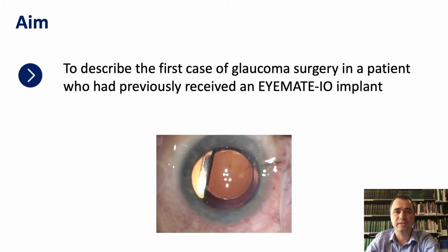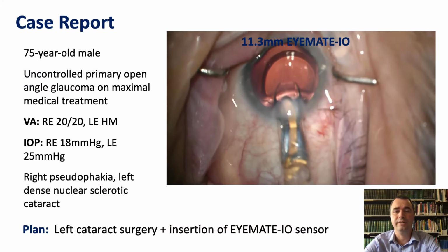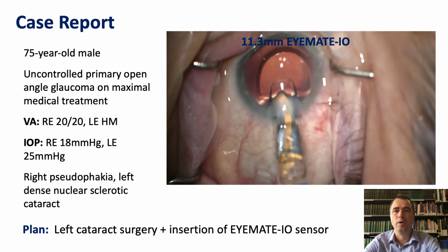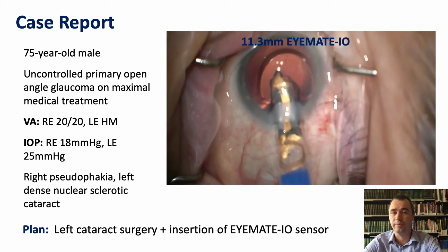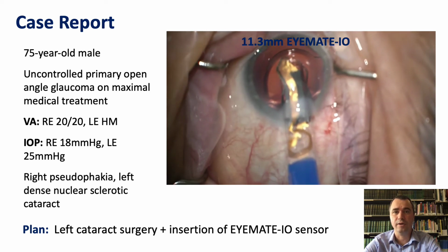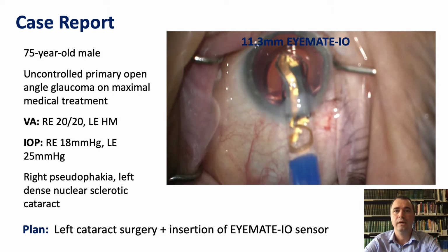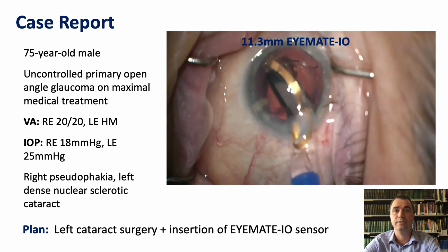The aim of this presentation is to describe the first case of glaucoma surgery in a patient who had previously received an EYEMATE implant. The case involves a 75-year-old male with primary open-angle glaucoma, uncontrolled on a maximal medical treatment. His pressure preoperatively was 25. He had a dense cataract with vision of only hand movements. It was decided to perform a left cataract extraction combined with the EYEMATE procedure.